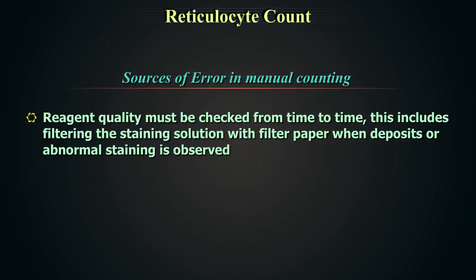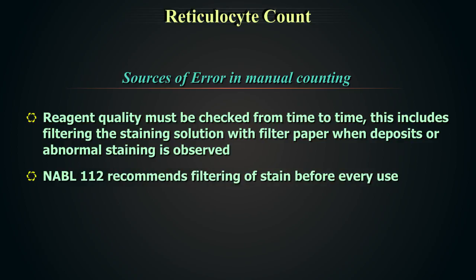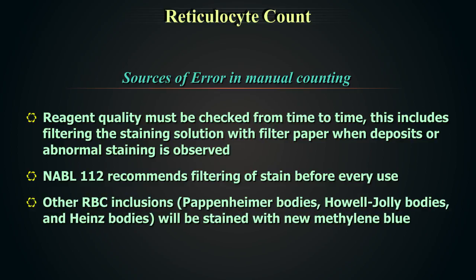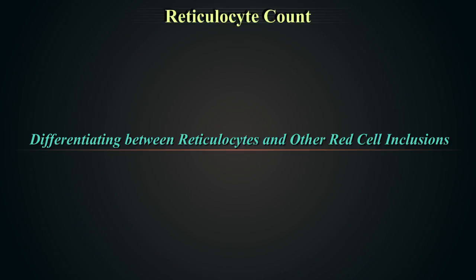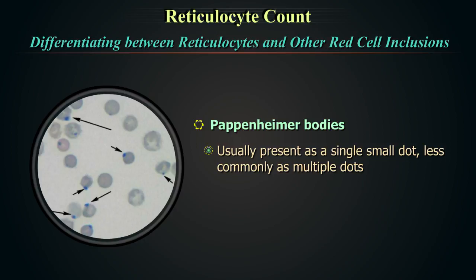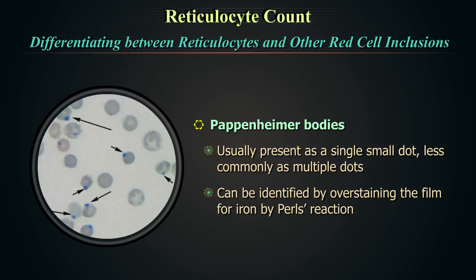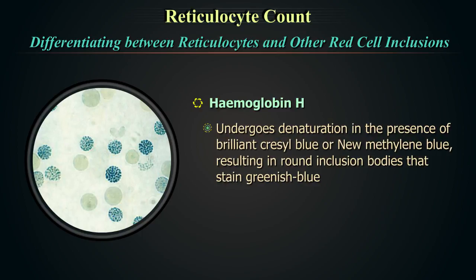Sources of error in manual reticulocyte counting include reagent quality, which must be checked regularly by filtering the stain solution when deposits or abnormal staining is observed. NABL112 recommends filtering the stain before each use. Other RBC inclusions such as Pappenheimer bodies, Howell-Jolly bodies, and Heinz bodies are also stained by new methylene blue. Pappenheimer bodies usually present as a single small dot or multiple dots, staining a darker shade of blue than reticulofilamentous material, and can be identified by iron staining with Perl's stain.